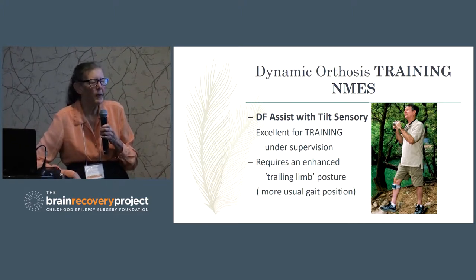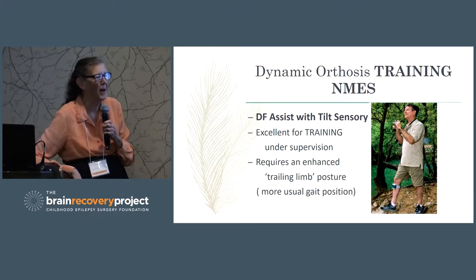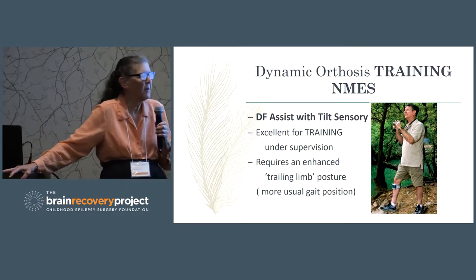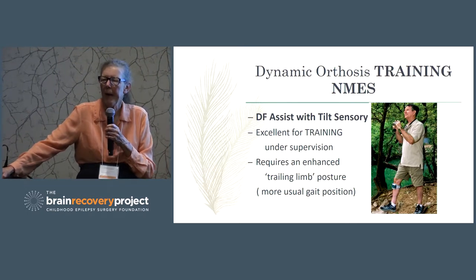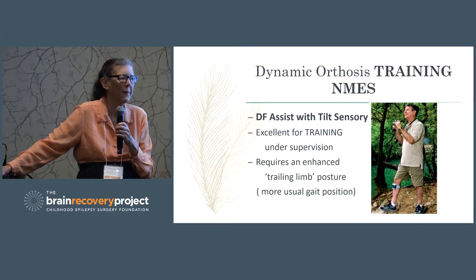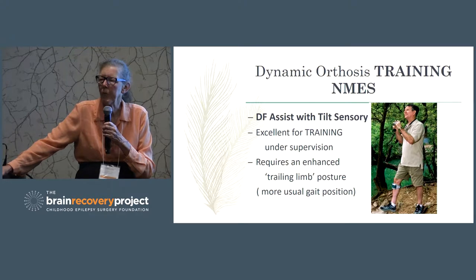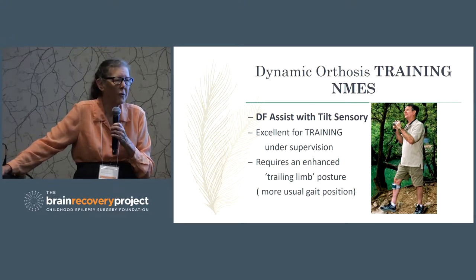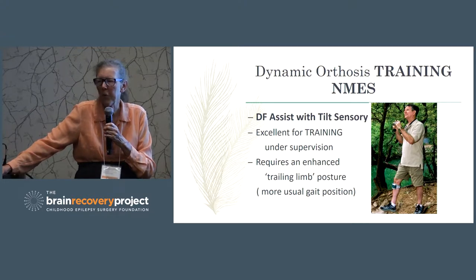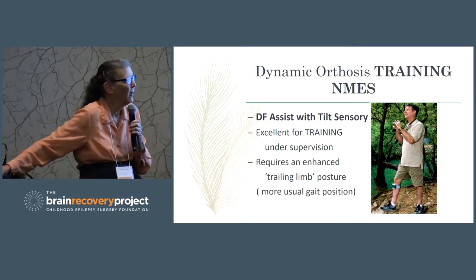When I first began doing electrical stimulation, which we will not say when that was because some of you weren't even alive yet, we were doing this kind of stimulation, but we were doing it with an implant. And we discovered that many of our patients learned how to do the task without the implant. But then we had the implant in there, so what were we going to do? It was basically on that basis that we started using the surface stimulation as a treatment assessment. And so this is not new, this goes back into the 60s, but it's a very nice toy to play with.